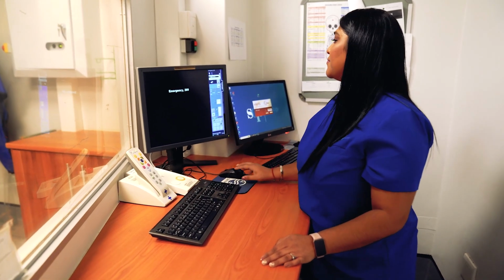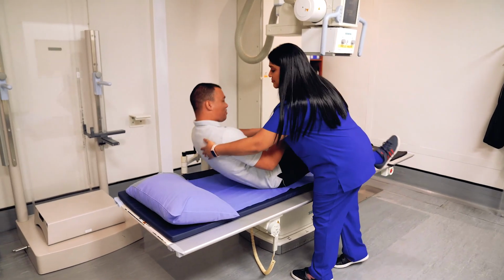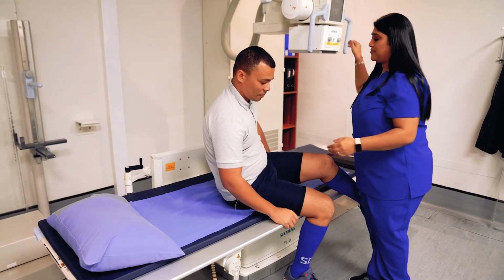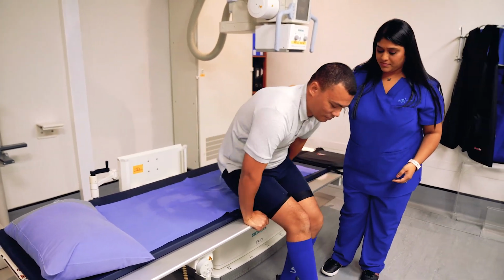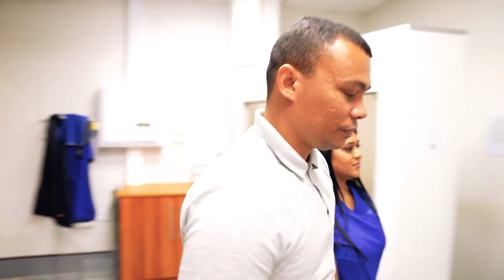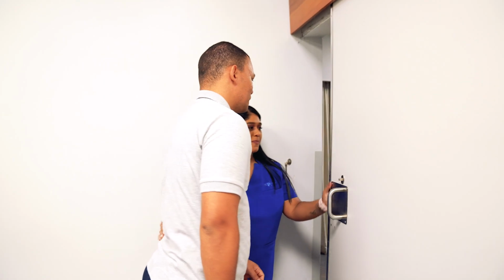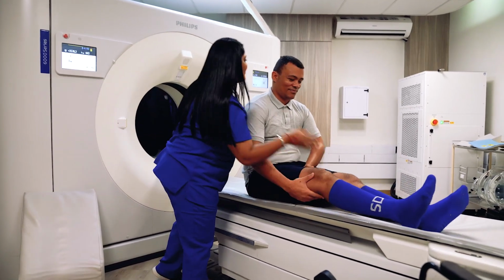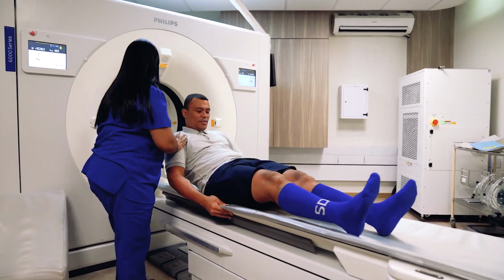So for example, in an acute bony injury, such as a shoulder dislocation or a clavicle fracture, an X-ray is an excellent tool and maybe the only imaging that is needed in that scenario. If there are more complex bony injuries, or a bony injury is suspected and not seen on an X-ray, then a CT scan is an excellent tool to look at the bones.